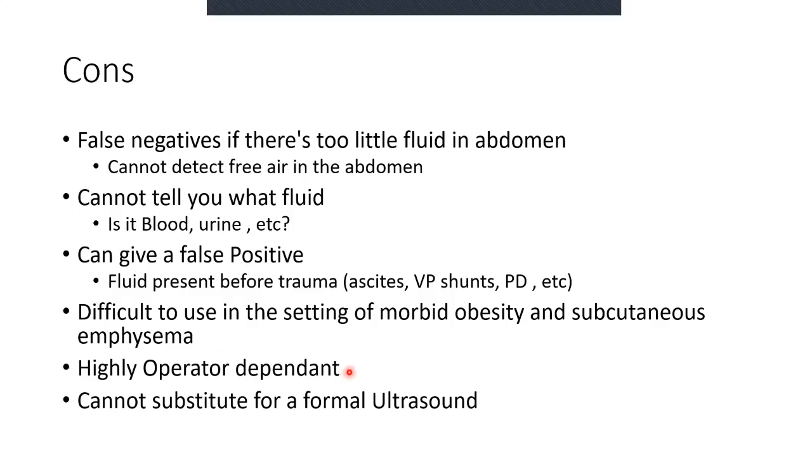Ultrasound is highly operator dependent. What that means is that an inexperienced provider is unlikely to find as many things as an experienced provider. So you have to understand your limitations as well. If you are in a new setting, let's say you work in a small hospital that does have an ultrasound machine, but you're not getting much instruction except from Dr. Mohammed, or you've read a book or something like that, and you scan like 1 or 2 patients a week, they're not really related to trauma, you're doing it on your own.